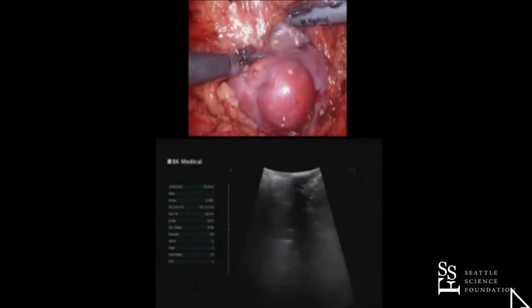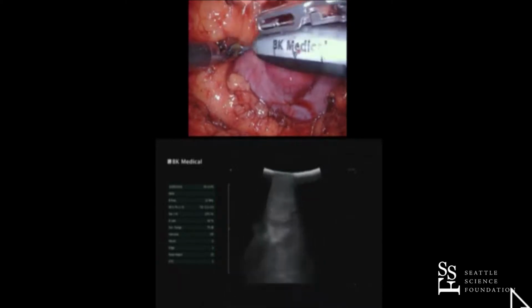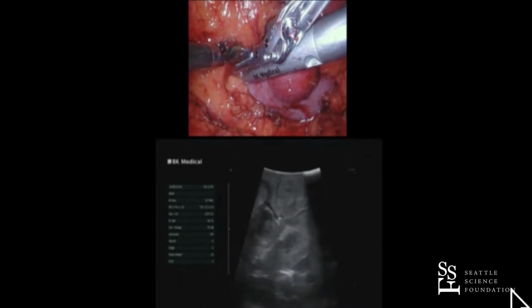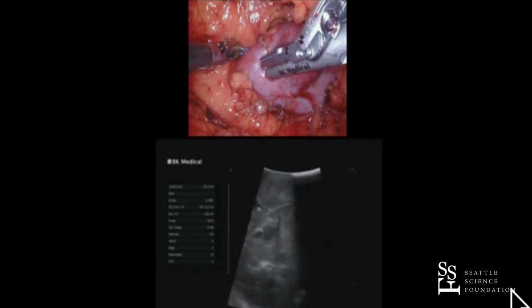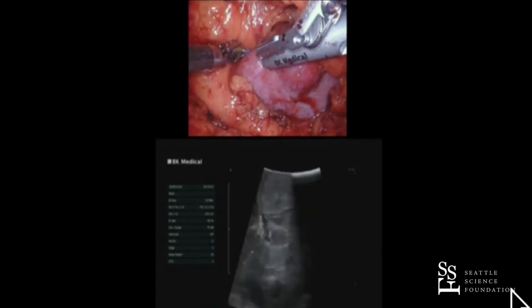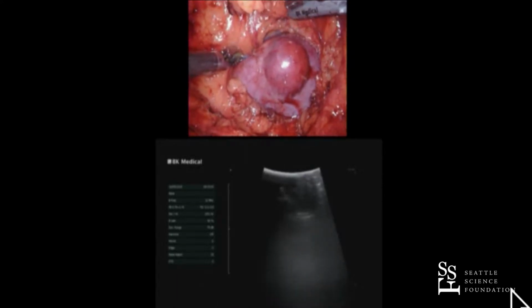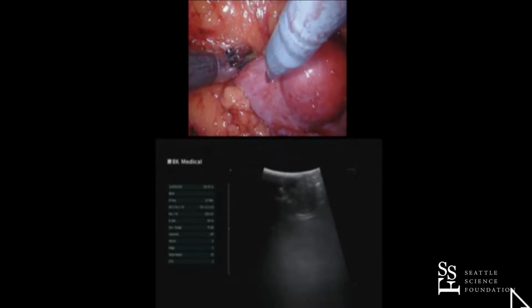It can be useful. So what I'm going to do now is use this ultrasound. The tip of the ultrasound probe corresponds to the left side of the ultrasound view. I'm going to pull the probe back until the tumor touches the left side of the view, which is right there. That tells me where the tumor is, so I can make a mark right there. That's my cephalad extent of the tumor. I'm going to give myself a couple millimeters more.